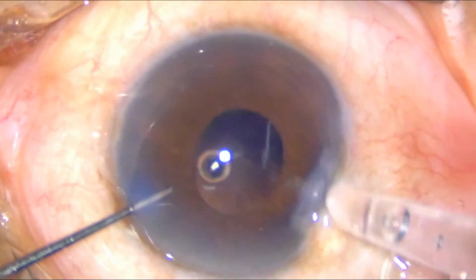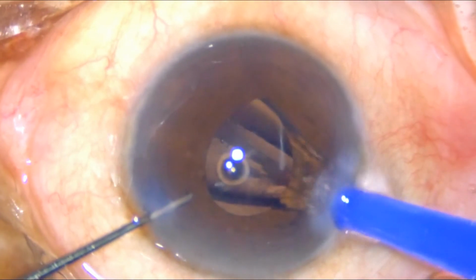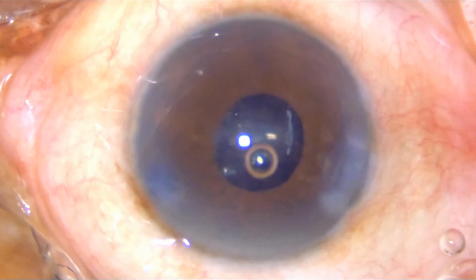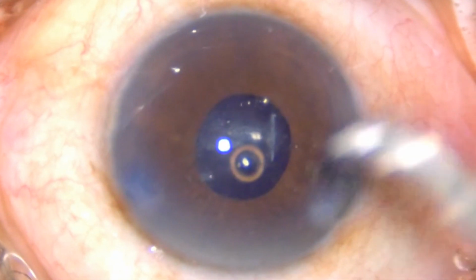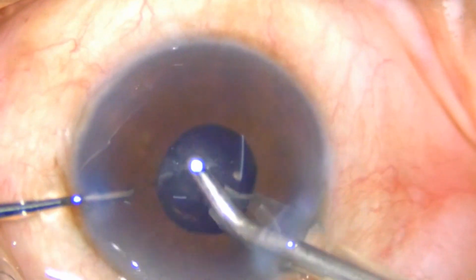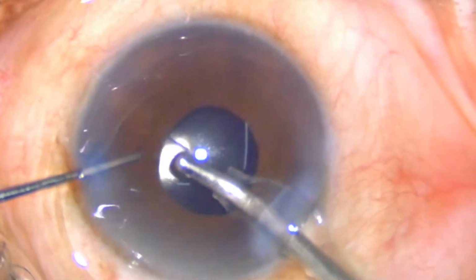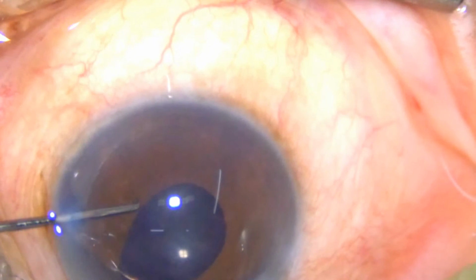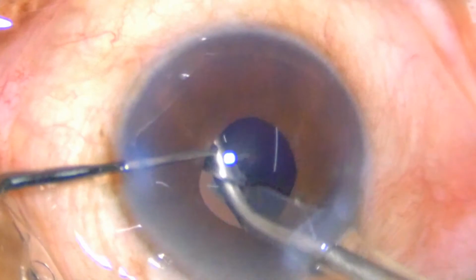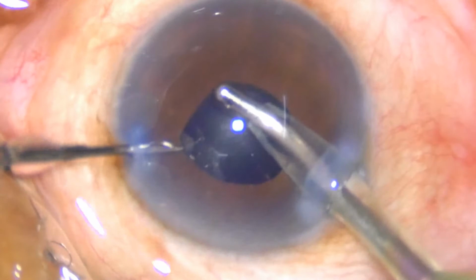While injecting the IOL, try to keep a vertical direction so that your leading haptic goes directly into the bag, and with the help of the left hand you can direct the trailing haptic into the bag. Again, for viscoelastic wash, use high vacuum, high flow rate. Try not to go very close to the pupil margins. You can still, even in a small pupil, wash behind the IOL, and you can use your left hand to see the peripheral area for any left out cortical material.